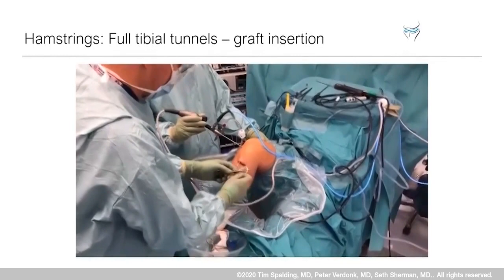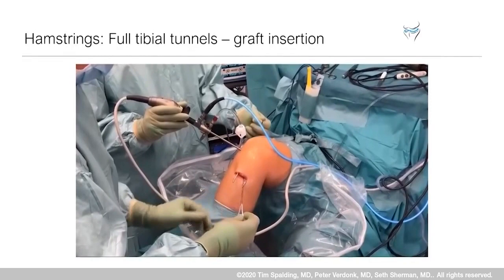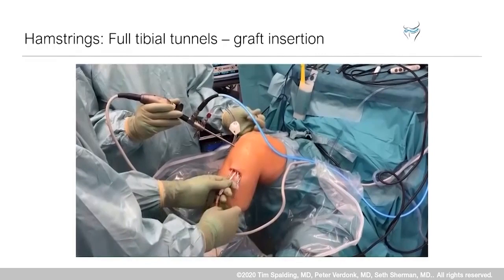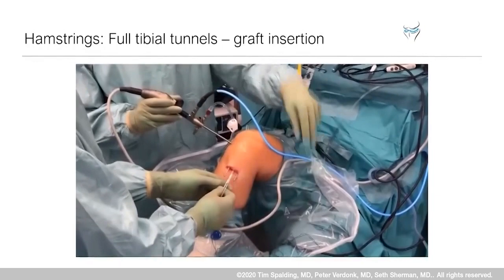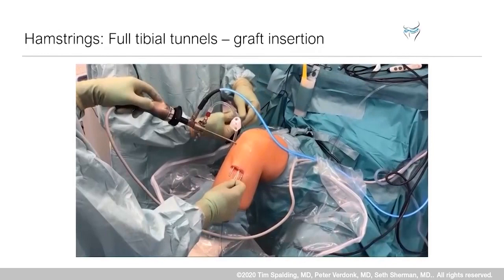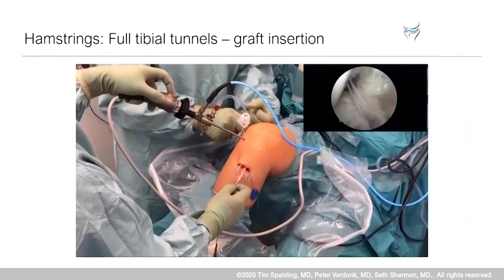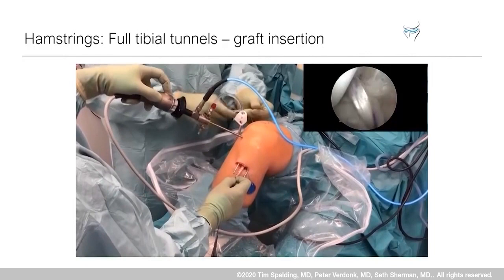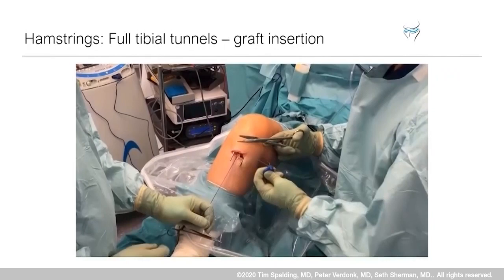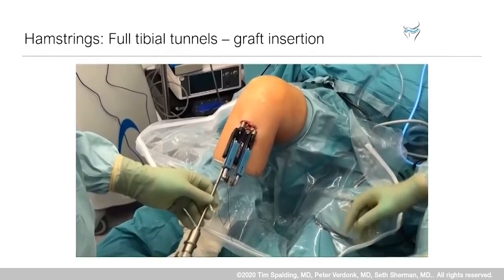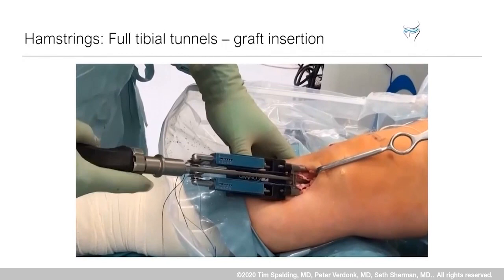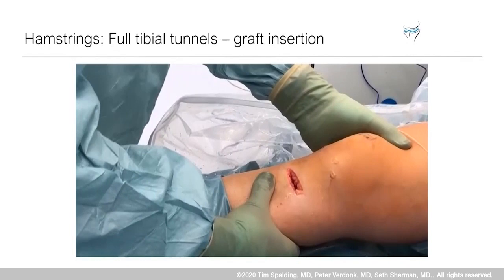To pass the graft we use the tensioner system, passing the ends of the infinity loop up through the tibia and pulling out through to the lateral side of the femur. The adjustable loop button is pulled into the knee using the blue and white lead suture. Viewing from inside, we see the 40-millimeter mark disappear into the femoral tunnel, meaning the button has reached the lateral femoral cortex. It automatically flips as you pull back, then the adjustable loop is tensioned by pulling the suture with the blue tag. We then remove the reversible loop and fix it using the tensioner system or interference screw.